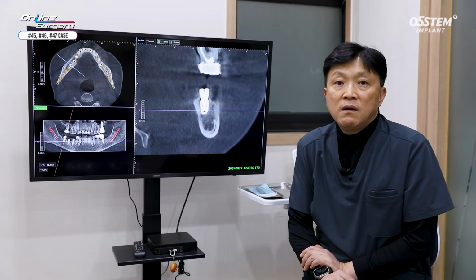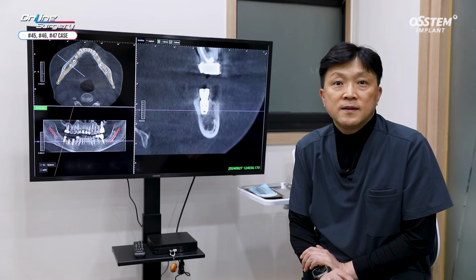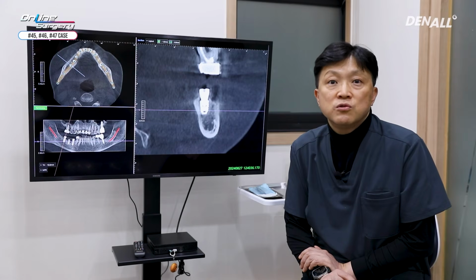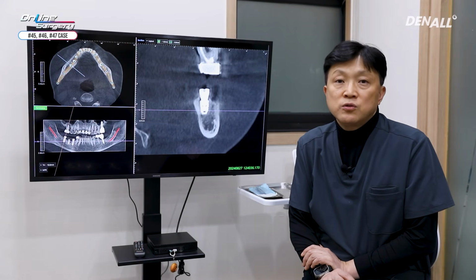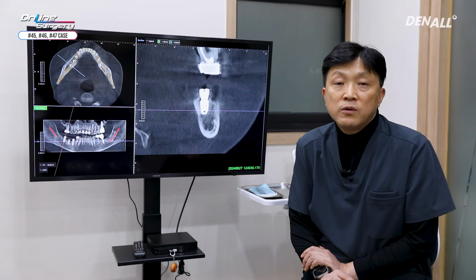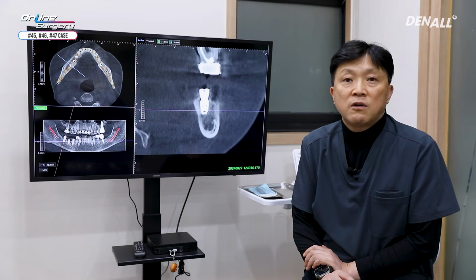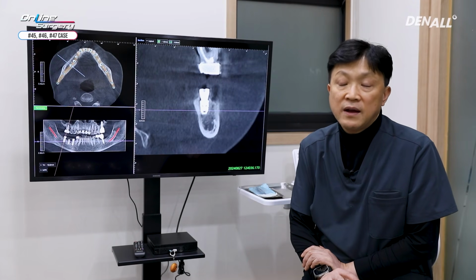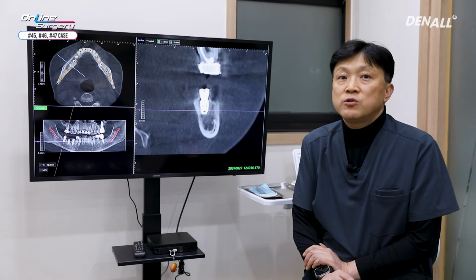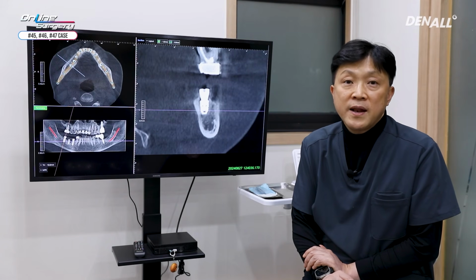One of the issues that can arise from using OssBuilder is exposure after surgery. For me, 8 weeks is a standard, so I aim to prevent it from being exposed for 8 weeks. My usual protocol is to remove OssBuilder in the 16th week. Removing at that time seems safest to me, but if there is partial exposure after 8 weeks, I can consider removing it a little earlier.